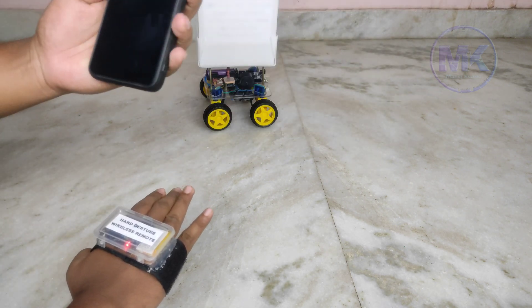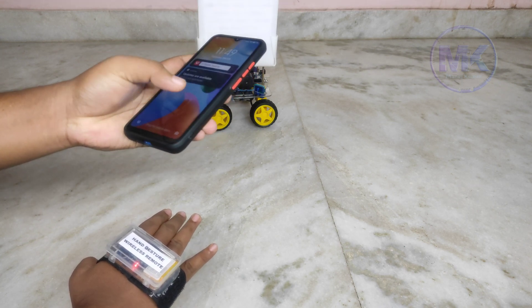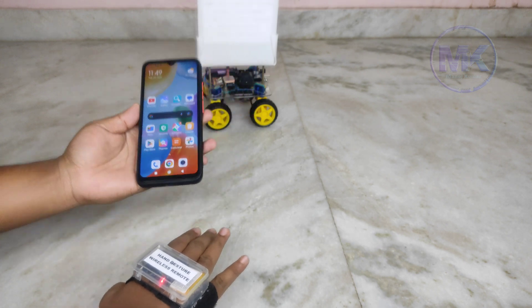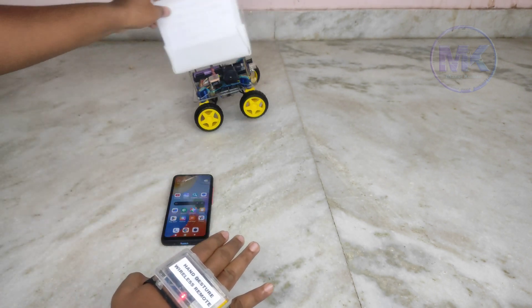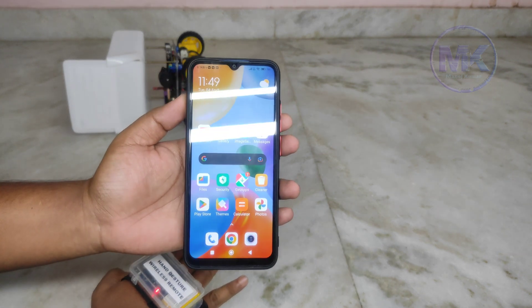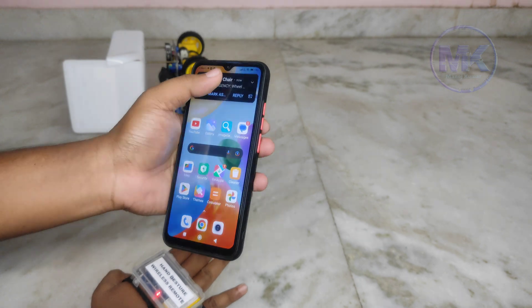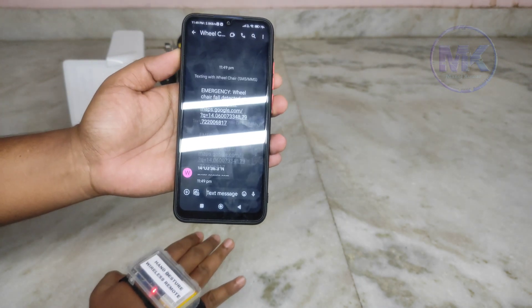Let's check the fall detection alarm and emergency message notification. The fall detection alarm has been activated.